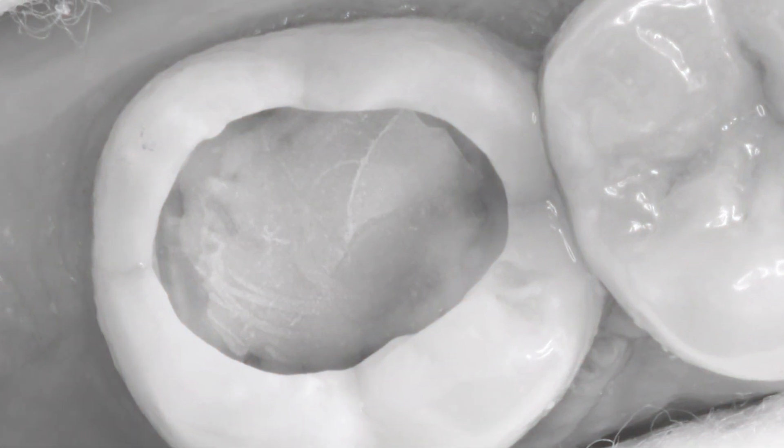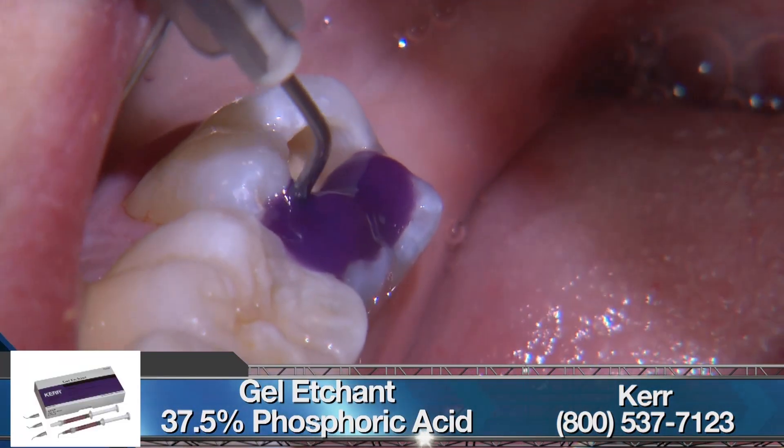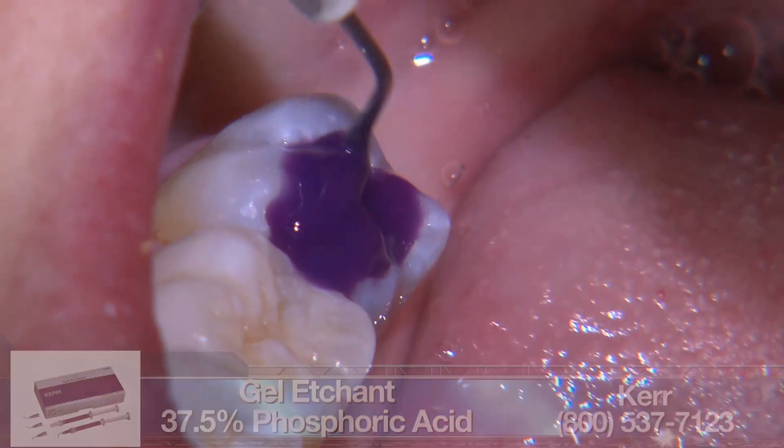Now the cavity is ready for bonding. We etch with Kerr's 37% phosphoric acid and follow that with an adhesive application using 3M's Scotch Bond Universal.